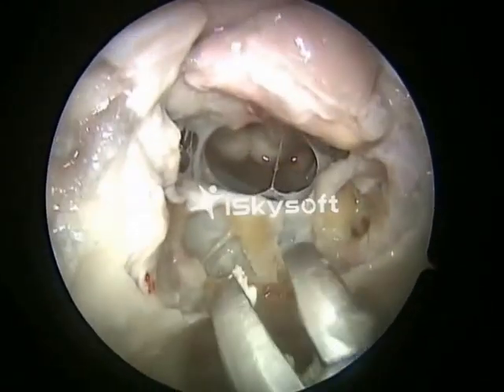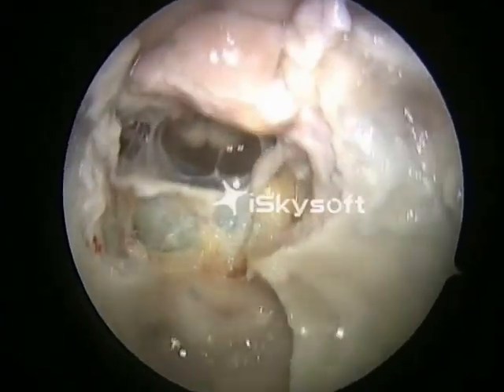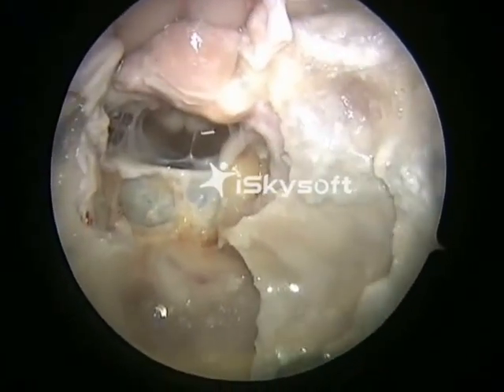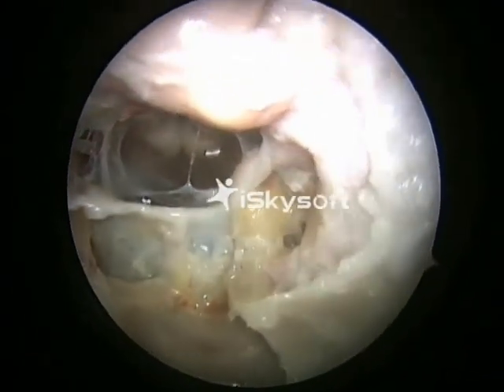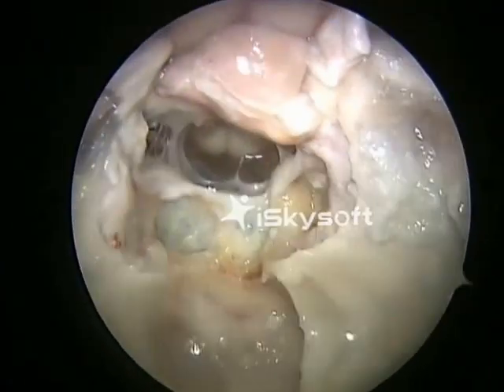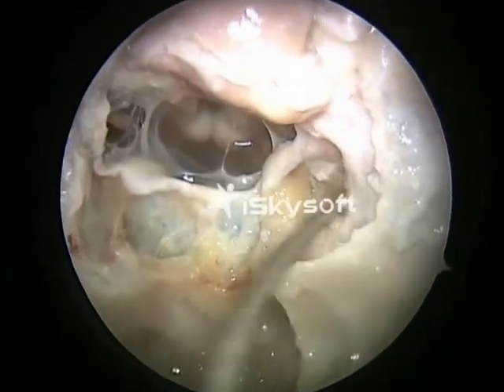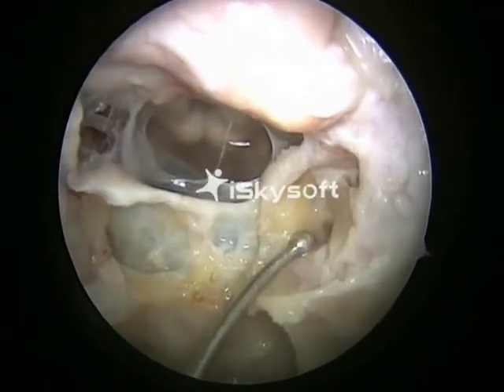That's the bone being removed. In a live situation, the posterior clinoid process is posterolateral to the internal carotid artery, and it is thinned out with a diamond burr and slowly teased out so that there is no damage to the internal carotid artery.